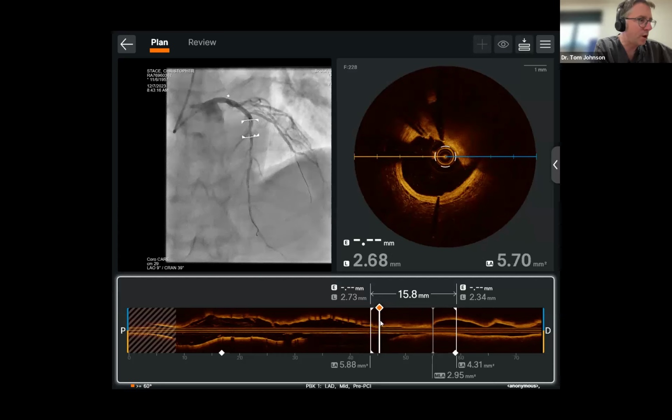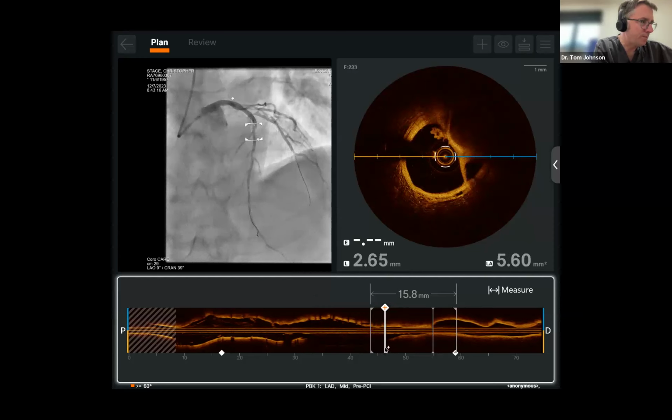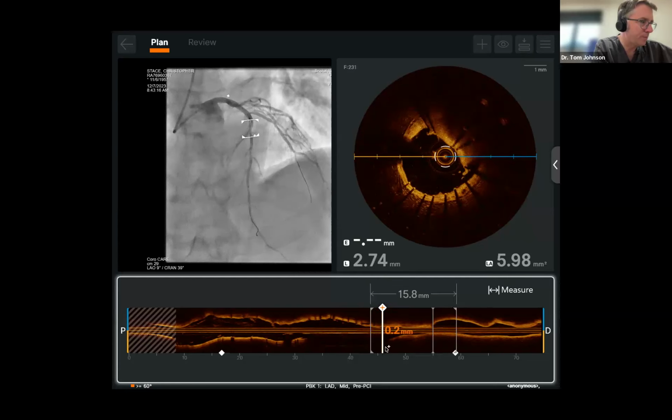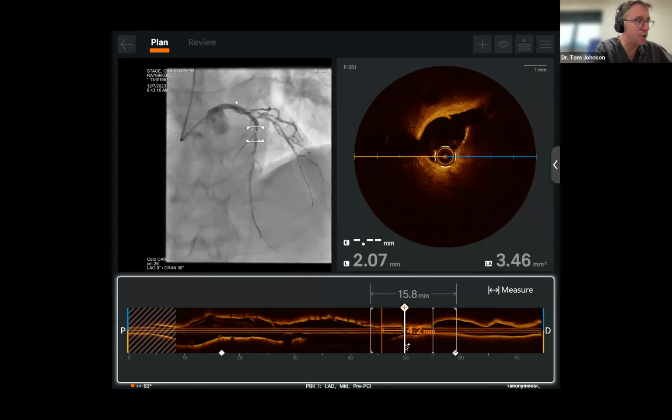Does it extend over 3 millimeters? Well, the stent edge is here. And so if we wanted to make a longitudinal measurement, then we'd measure it from the stent edge, which is this point. And we see it continue. It seems to just about normalize there. We're at 3.8 millimeters longitudinally, but actually we see more disruption at around 12 o'clock, and we see continuation of the dissection there.